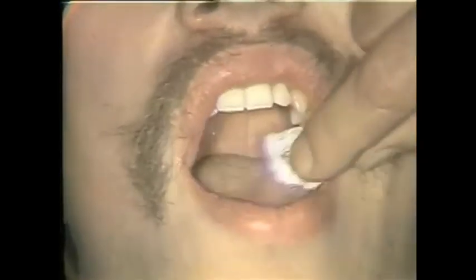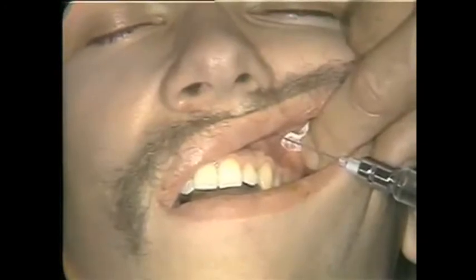If you'd open about halfway, Andy, for me, please. And now you might close just a little. Now with retraction of Andy's lip, you'll notice again these tense vestibular tissues. Now we're going to get just a little higher because of the length of the cuspid root. All right, we've made our puncture, and our needle bevel is against bone. And we'll inject 1.5 cc to 2 cc's of solution, and then out quickly.